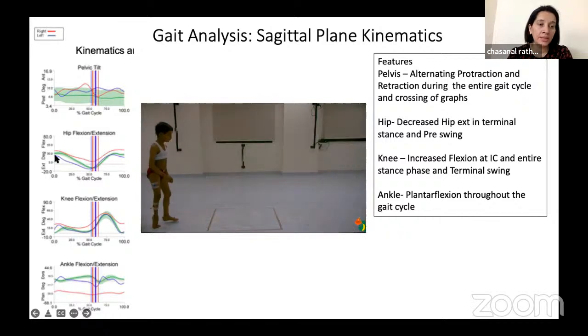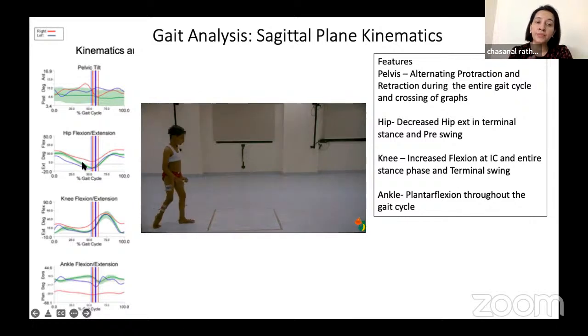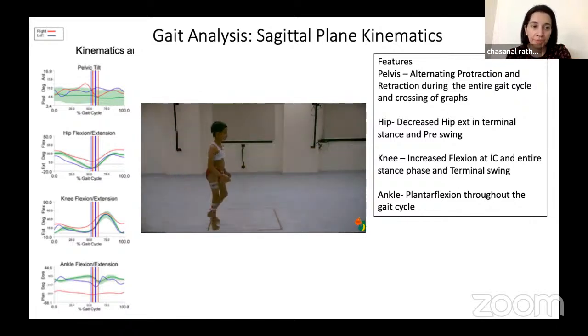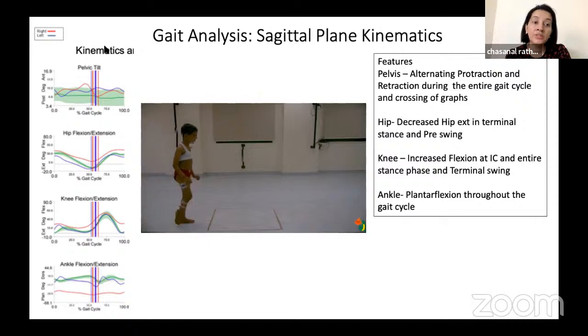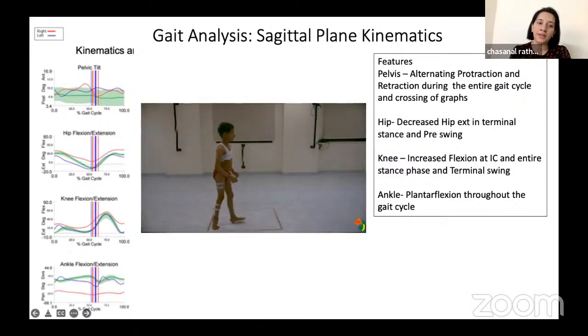The hip is typically good. If you see the right side, there is a slight decreased extension. Because of this equinus, this is compensatory. We saw in the clinical evaluation that there is no hip FFD. So we ignore this because we already know it's not the real hip flexion deformity here. He's walking with a hip flexion because of the severe equinus here.